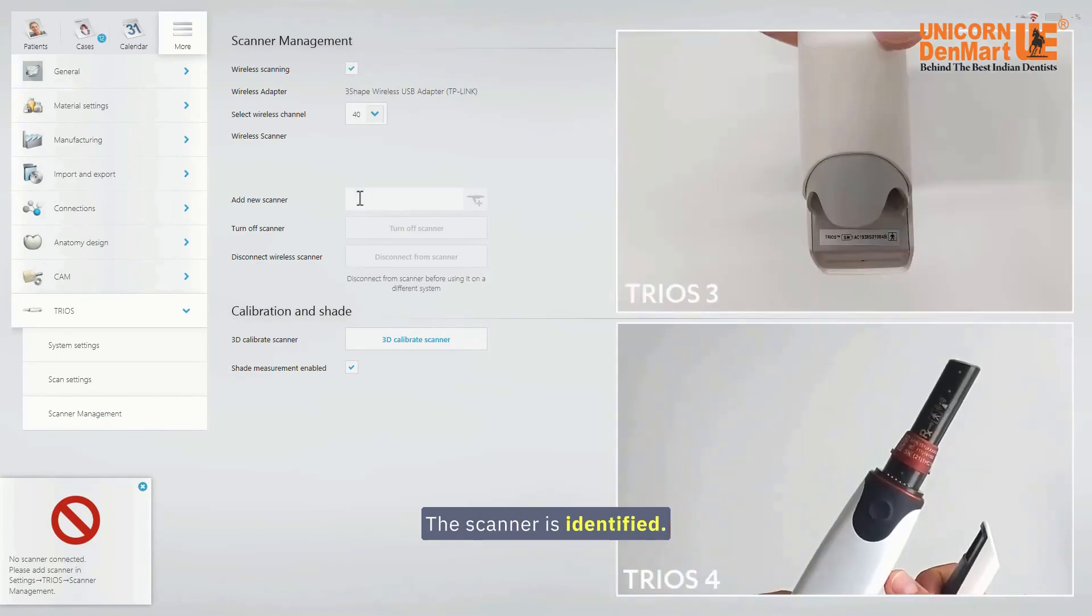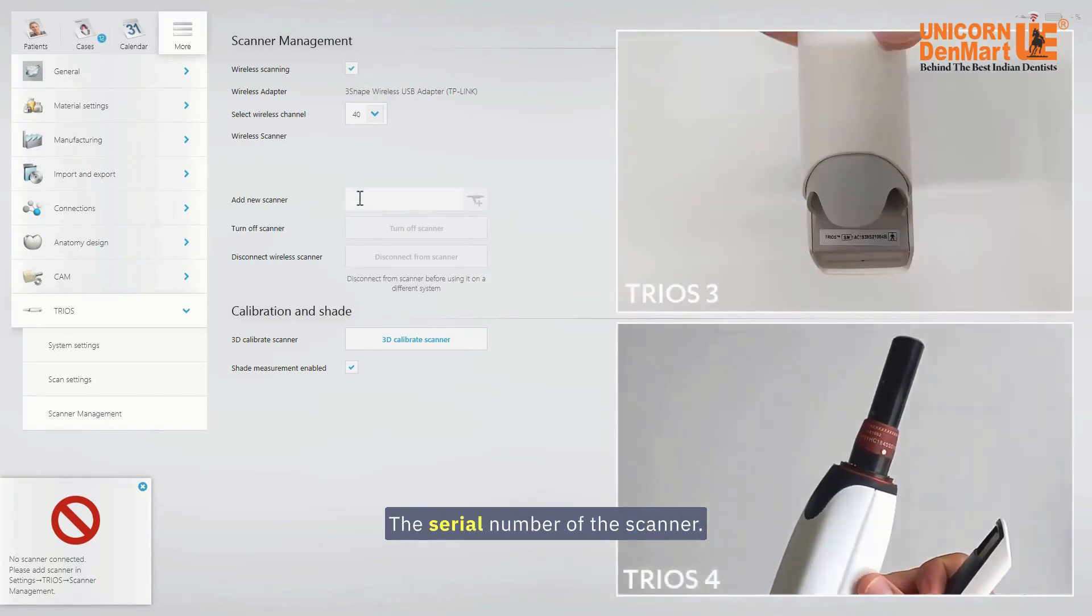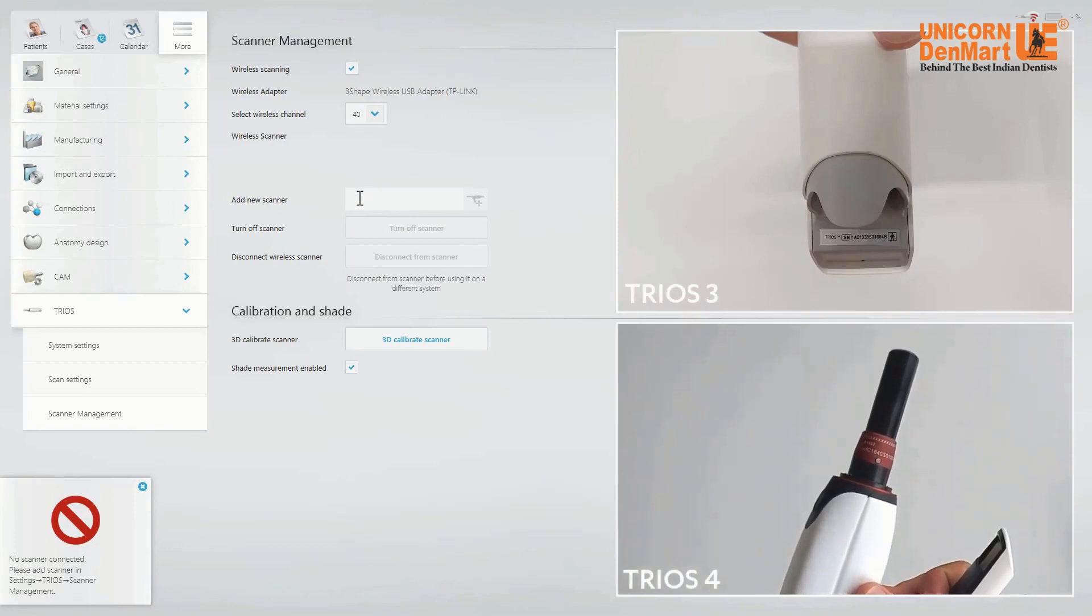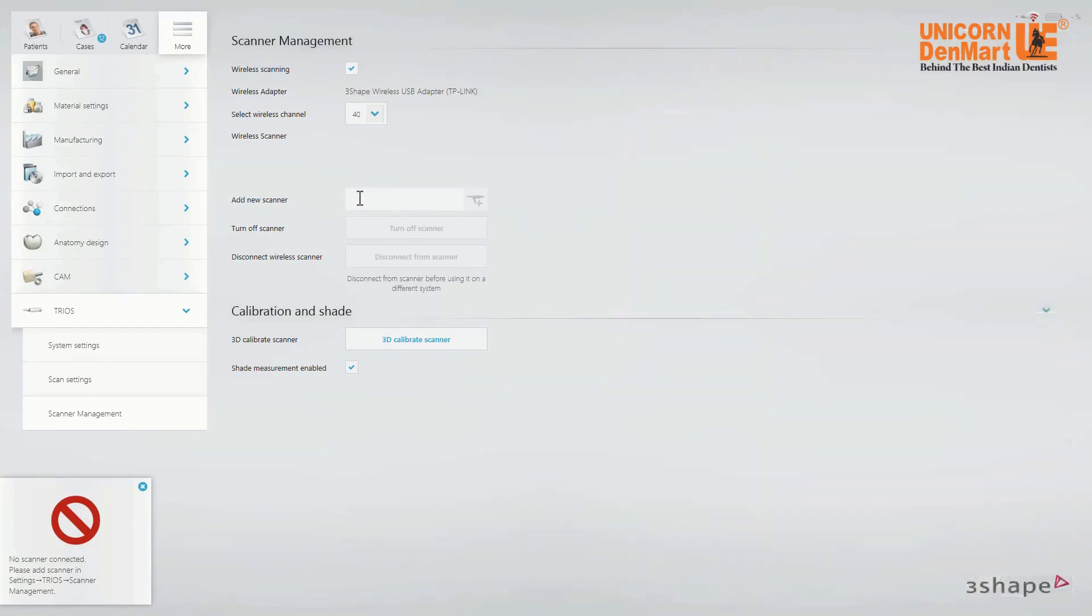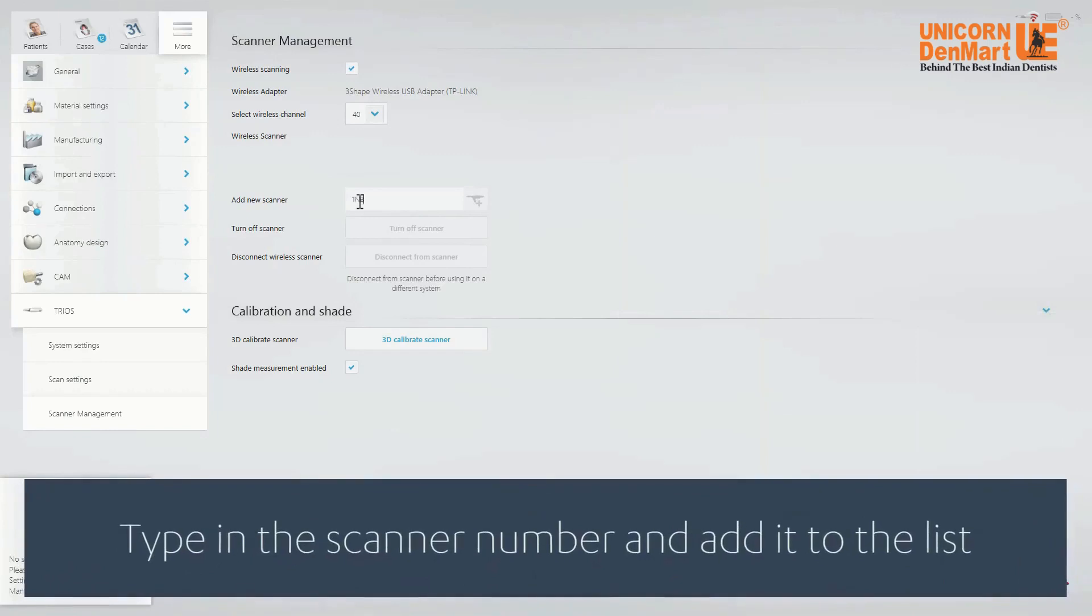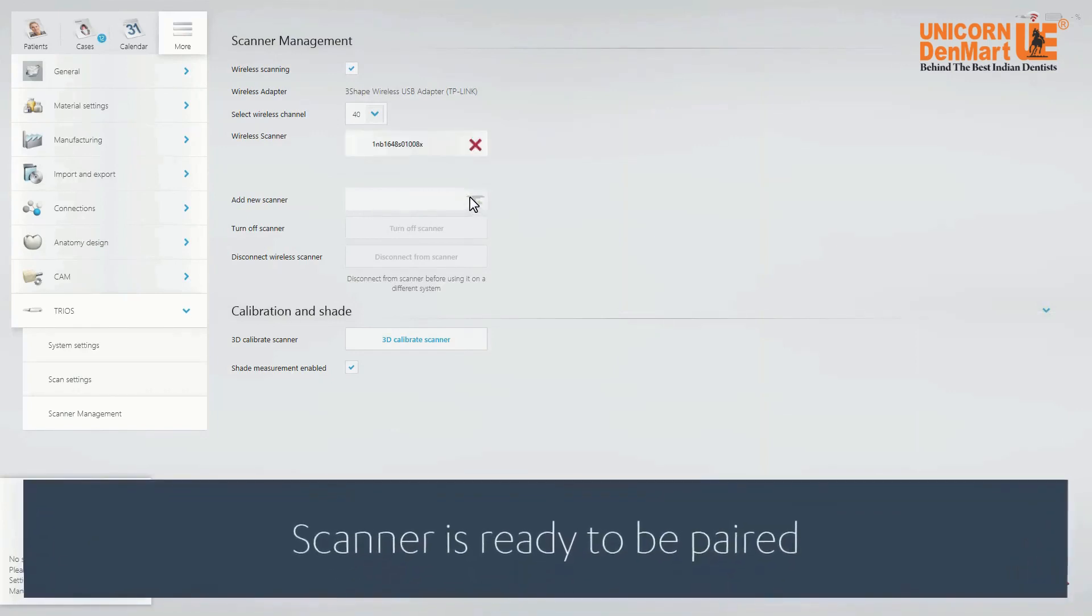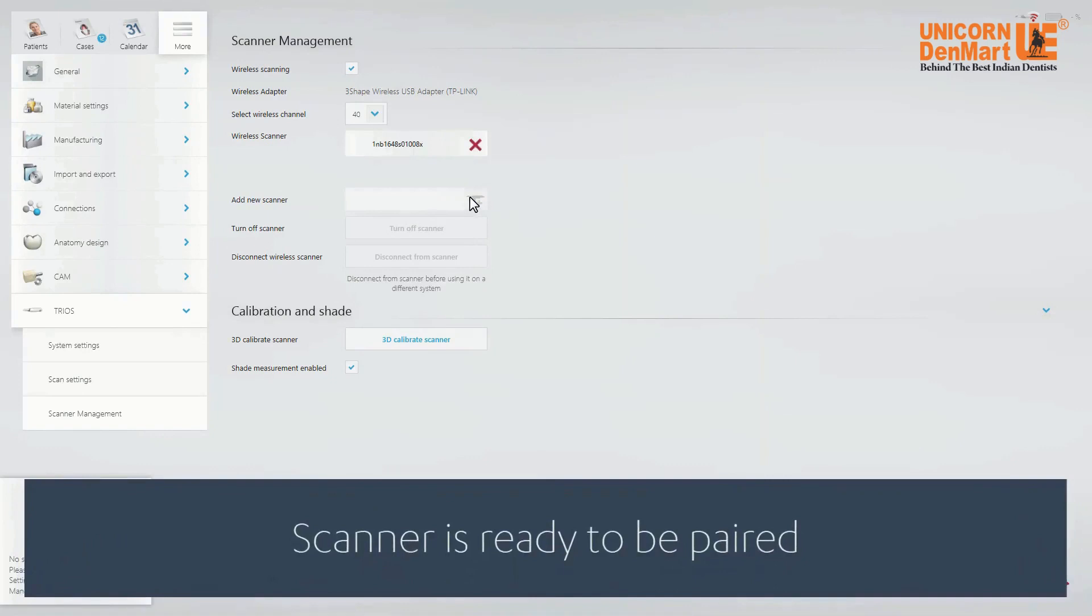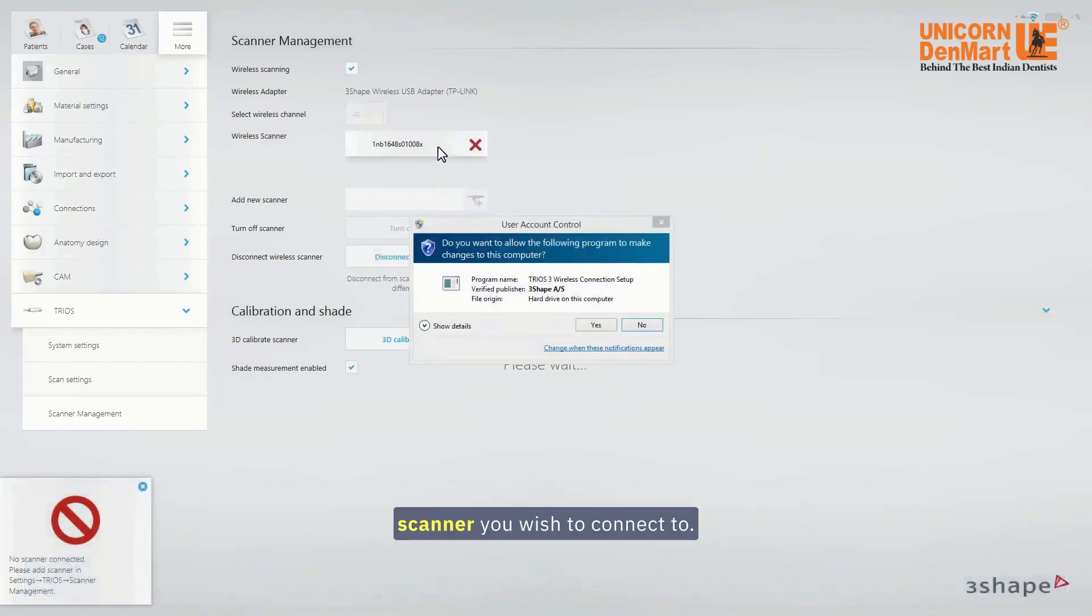The scanner is identified by the serial number of the scanner. Click on the serial number of the scanner you wish to connect to.